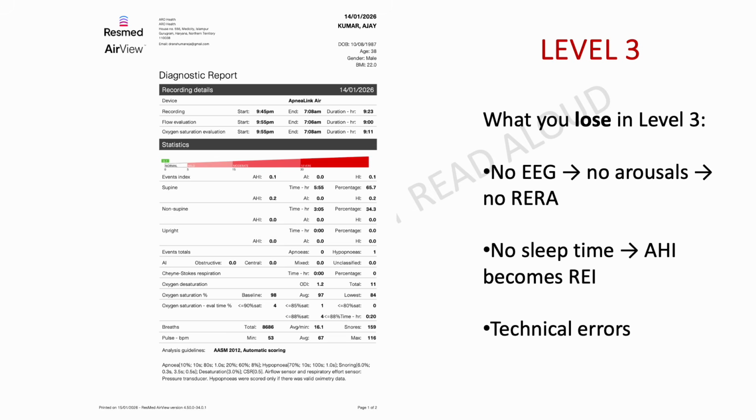Specifically, the AASM rules out home sleep apnea portable testing for patients with comorbidities. You can only do it in patients with very high suspicion without comorbidities. But then you can use this study for a lot of individuals who are otherwise healthy.